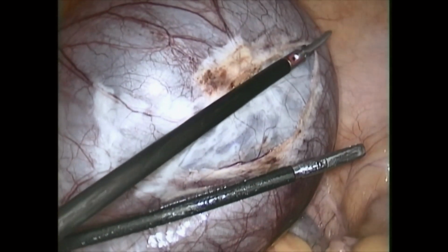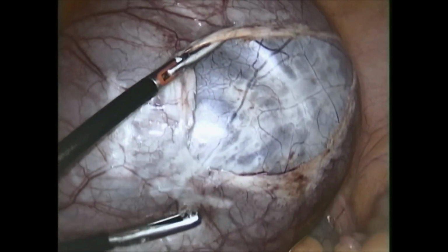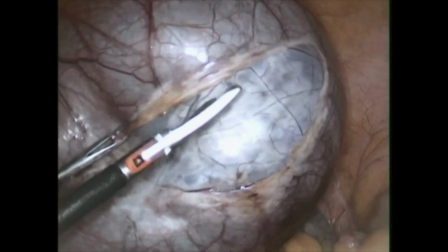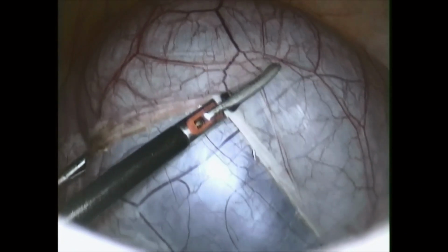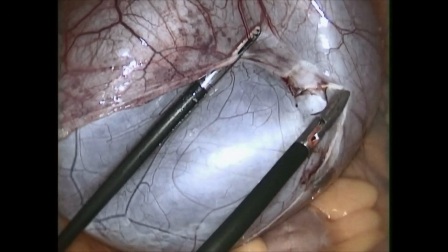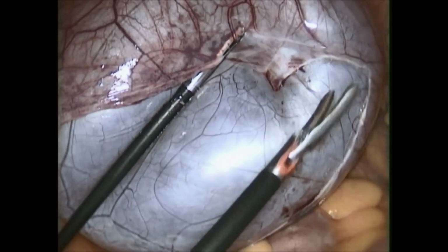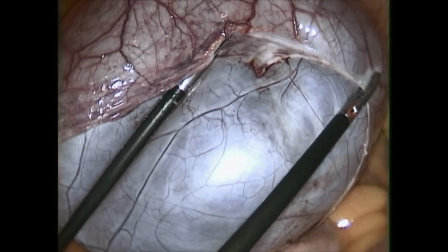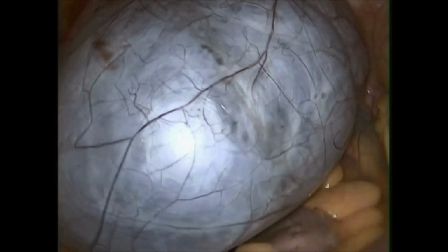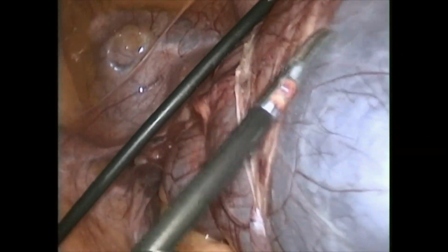These cysts are the easiest to remove. You only need to cut the mesosalpinx and just dissect it out. It is like a cakewalk for a laparoscopic surgeon. You can appreciate that it is coming out very easily. This portion I wanted to show you, that it is not arising from the ovary.